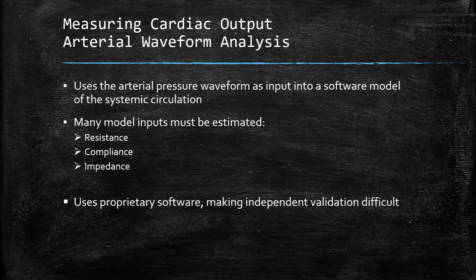Besides volume responsiveness, the other cardiac parameter that we would often like to know is cardiac output. There are several different approaches to this in clinical use, but they all have their limitations.